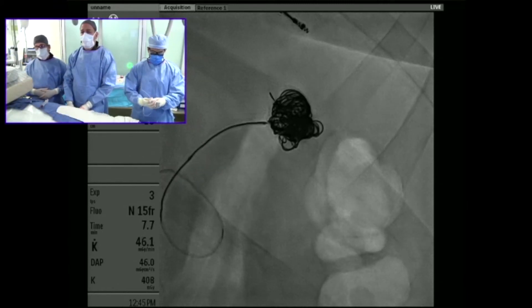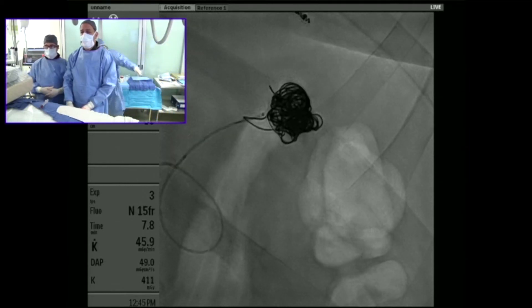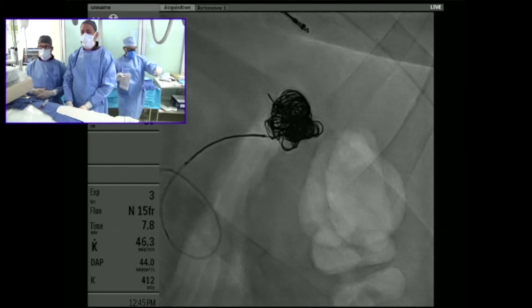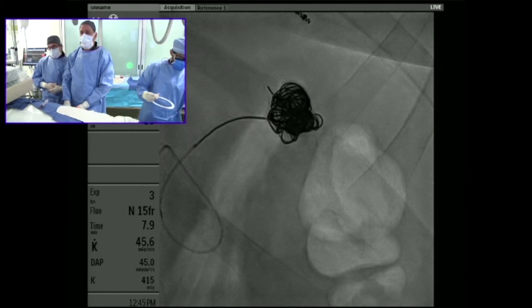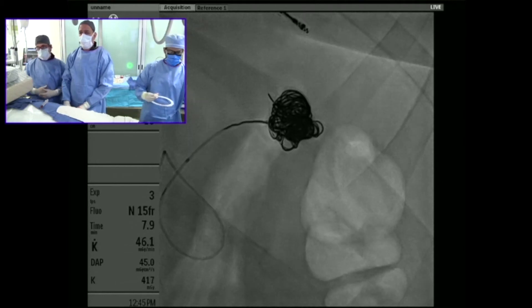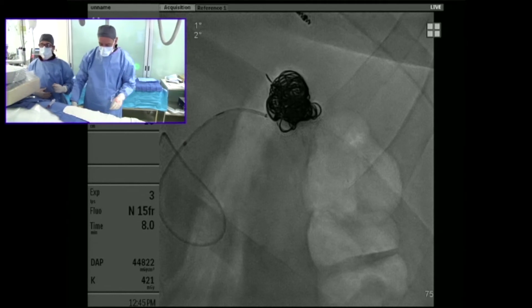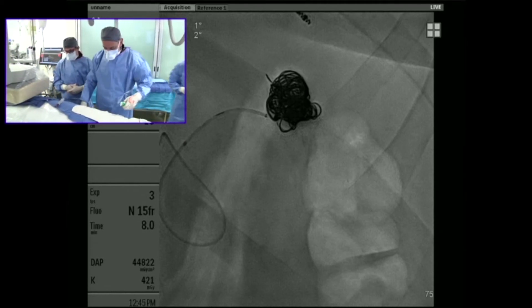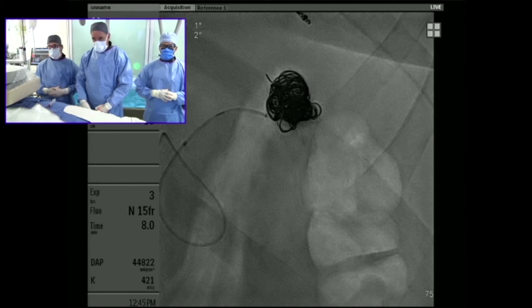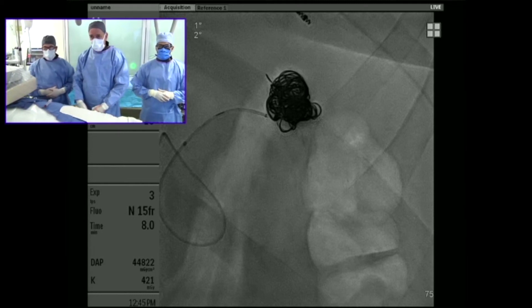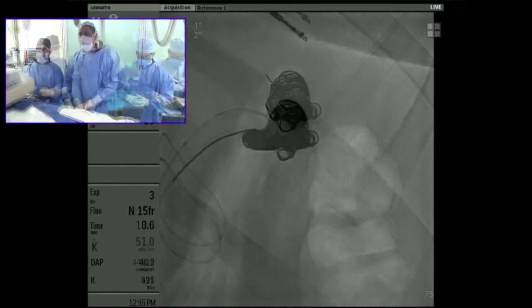We're going to stop when our coils start pushing out into the inflow artery. We want to fill the entire sac, and as you can see we're starting to push ourselves out of the sac and into the proximal segment. Rob actually redeployed that coil — he didn't like where it was, pulled it back, and got the rest of it into the aneurysm sac. We're trying to densely pack this to achieve very little flow.